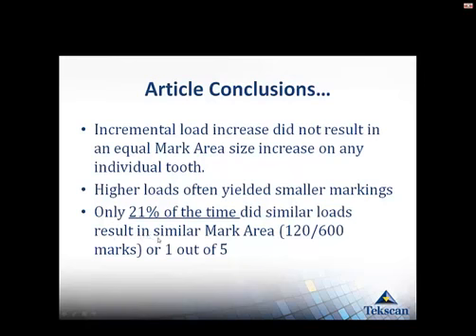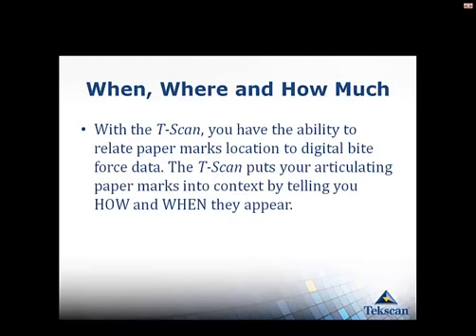And then the third thing here is that 21% of the time, similar loads resulted in similar mark size. So really, one out of five times. 79% of the time, it didn't result in the same mark size. And so I think that's important. It opened my eyes, and I think it will open yours as well.